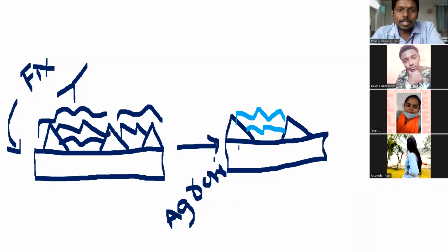Yes, thank you. See, now we got antigens, and these antigens have crosslinks. Now our idea is to remove these crosslinks, and removing the crosslinks among the antigens is called antigen retrieval.